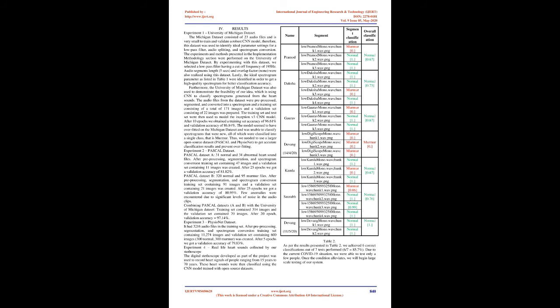After post-processing, the result is returned by the API and stored in the DynamoDB along with other patient information. These results are then displayed on the mobile application. For better classification accuracy, the users are asked to input heart sounds of above 24 seconds. For results, Experiment 1: University of Michigan dataset.